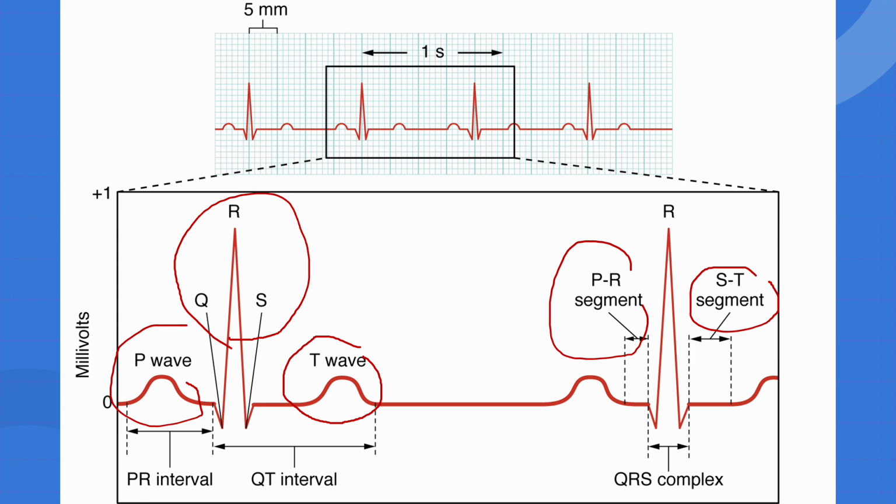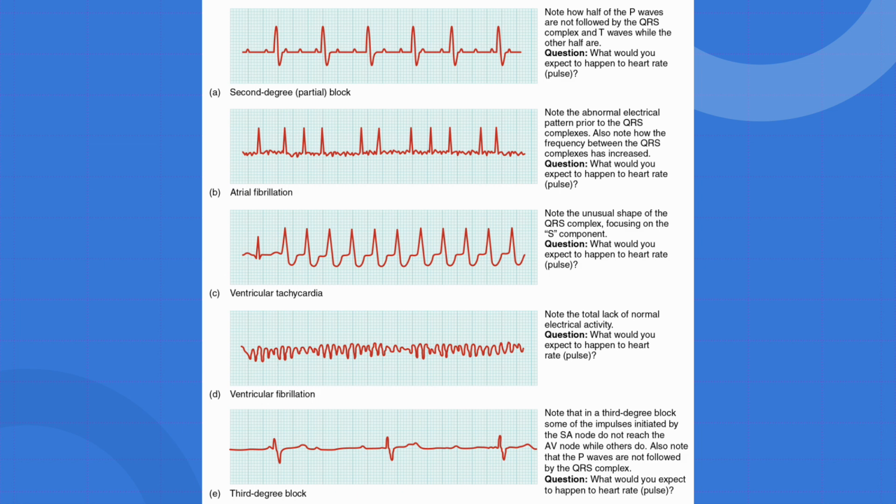The common arrhythmias. These are common arrhythmias and their ECG patterns. So, this is atrial fibrillation. This irregular rhythm has no distinct P waves. It indicates uncoordinated atrial activity and increases stroke risk.